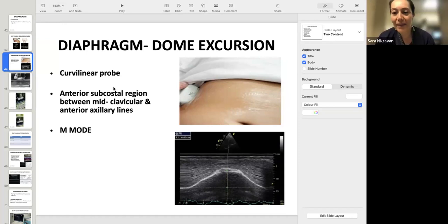And I think to your point, that's a really good point. Of course, practice is key for recognizing what the structures are and how to manipulate them. One thing that I wondered too is if it isn't very helpful to make sure you find the liver, make sure that you can at least see the liver, because sometimes in patients who are large, you don't really know where the structures are.